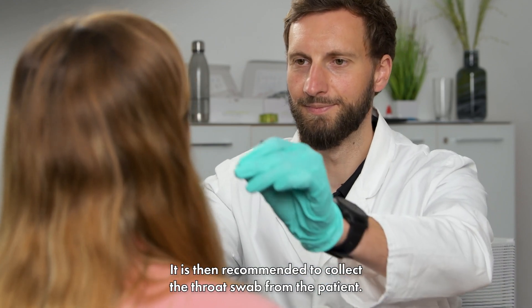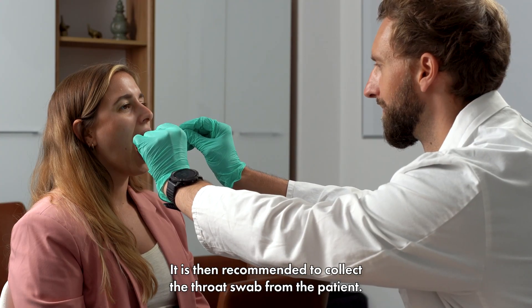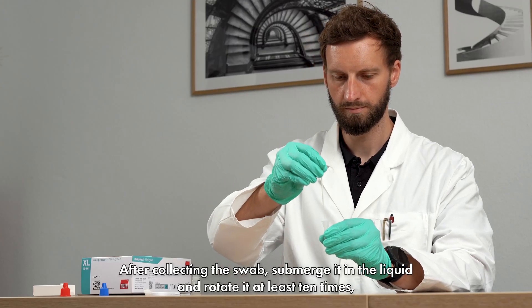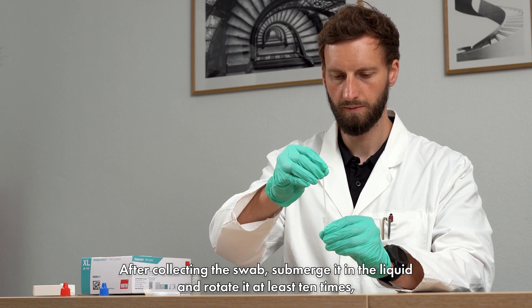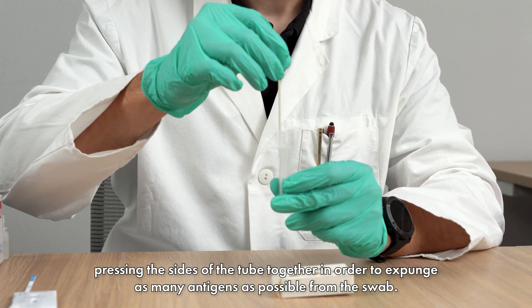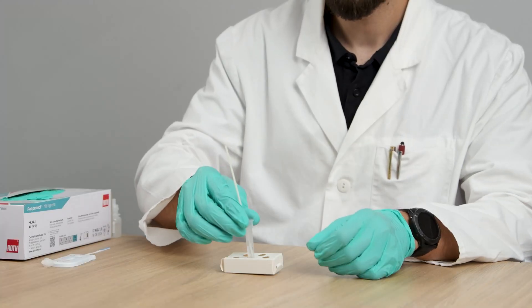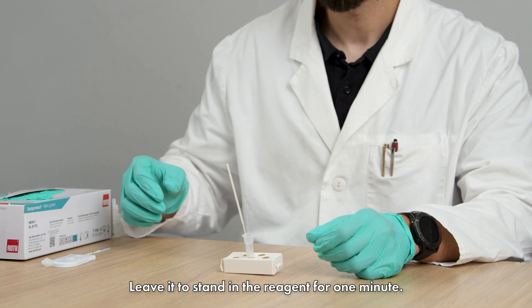Mix them together by carefully swirling the extraction tube. It is then recommended to collect the throat swab from the patient. After collecting the swab, submerge it in the liquid and rotate it at least 10 times, pressing the sides of the tube together in order to expunge as many antigens as possible from the swab. Leave it to stand in the reagent for 1 minute.